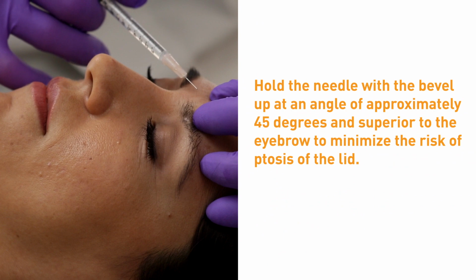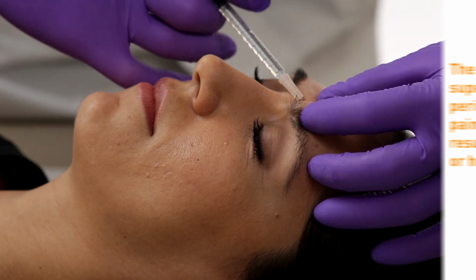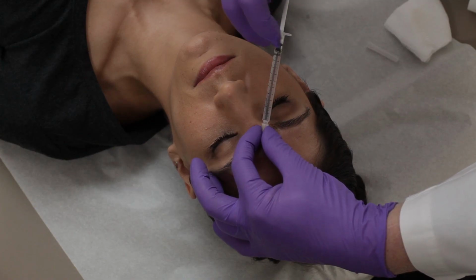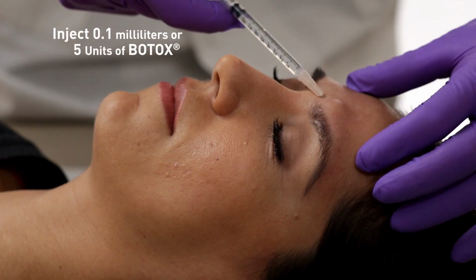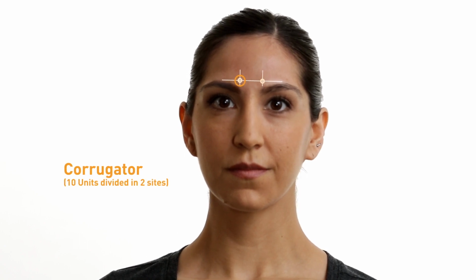Hold the needle with the bevel up at an angle of approximately 45 degrees and superior to the eyebrow to minimize the risk of ptosis of the lid. In addition, the needle should be kept superficial to avoid hitting the periosteum, which may be very painful for the patient and may result in a periosteal hematoma or headache. Stabilize the hub of the needle with one hand to make sure it does not twist in the skin, and inject 0.1 milliliters or 5 units of Botox with the other hand. Repeat this procedure symmetrically on the contralateral side.